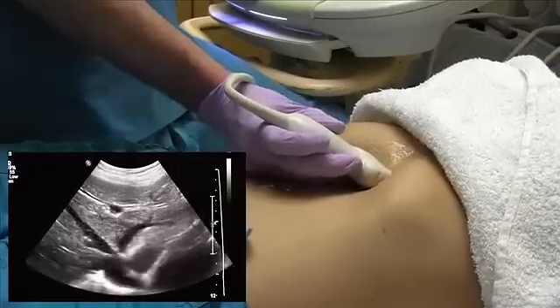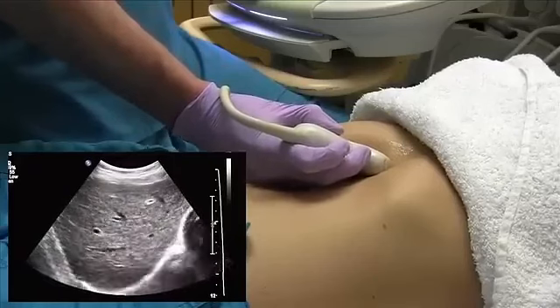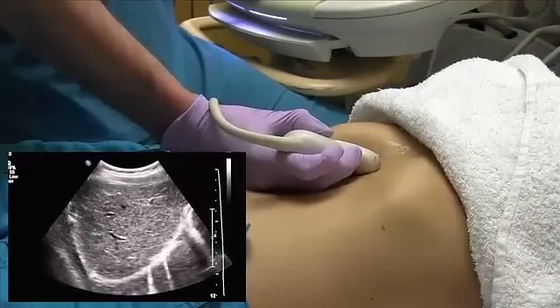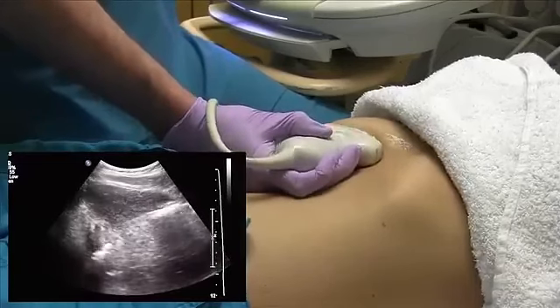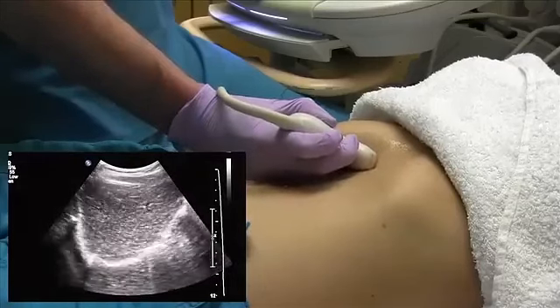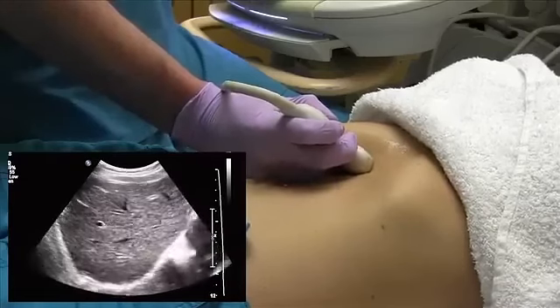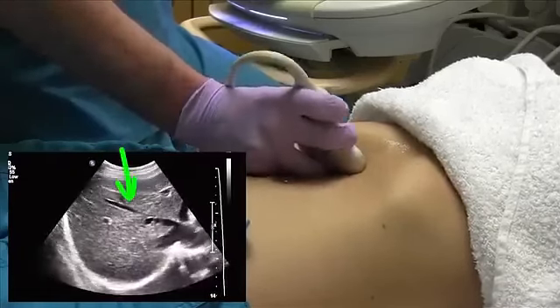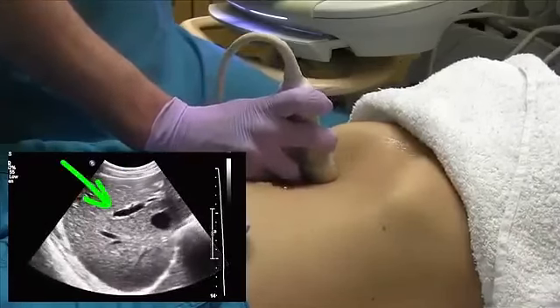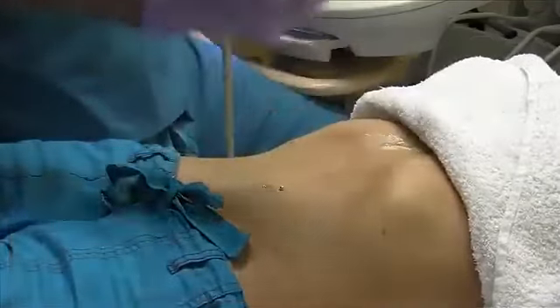So now from the left lobe, which is right here, you're going to angle slightly over and you should see the right lobe come into view. So you angle all the way up through the dome of the right lobe and start to come down. You get the parenchyma. Coming down, you'll see the hepatic veins again, and then you'll also come into the portal. And from here we just sweep all the way out of the liver.